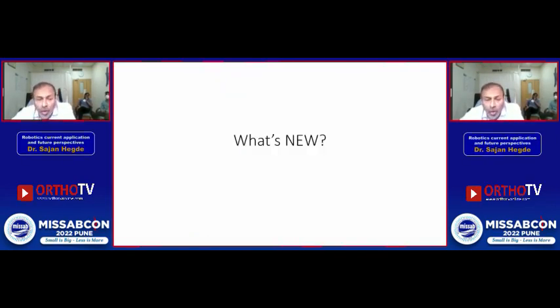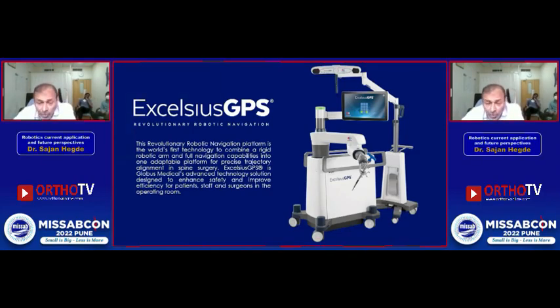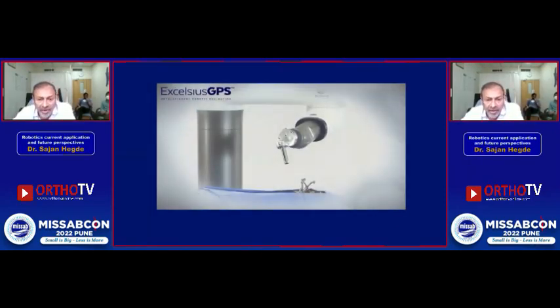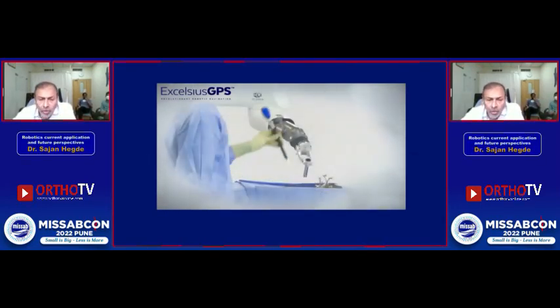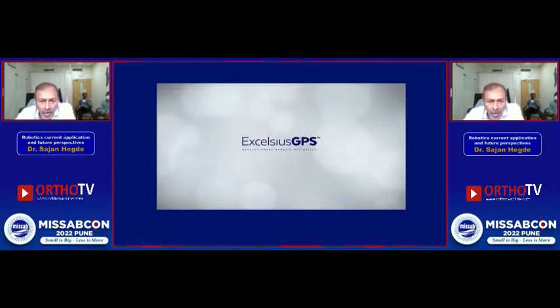So what is new? We have now shifted to a new generation robot, and this is called the Excelsius, which we have been using for the last 3 years. It is much more user-friendly, and the robotic arm moves in all directions. It is floor-mounted, and this is most important for me. It is very rigid. You can hang from the robotic arm. That's how rigid it is, and it moves into perfect placement so that you can get your screw into the exact placement where you want.